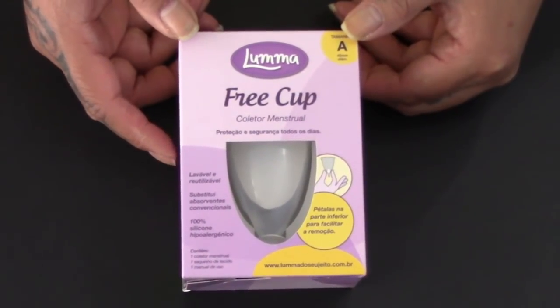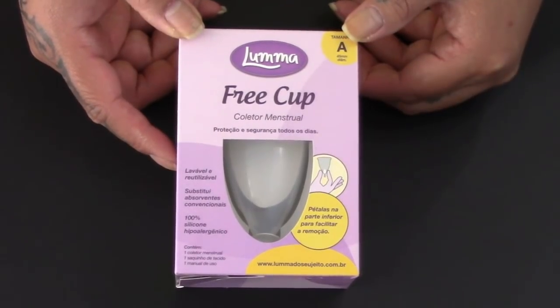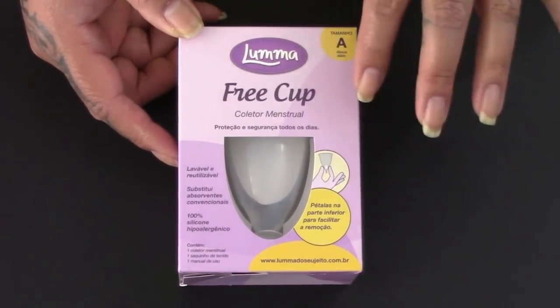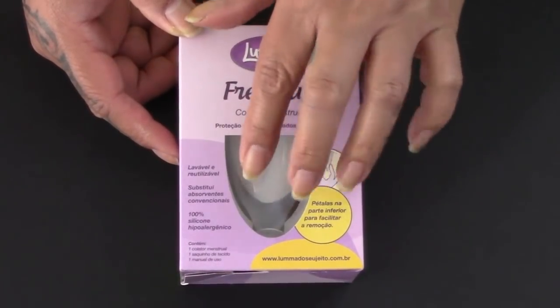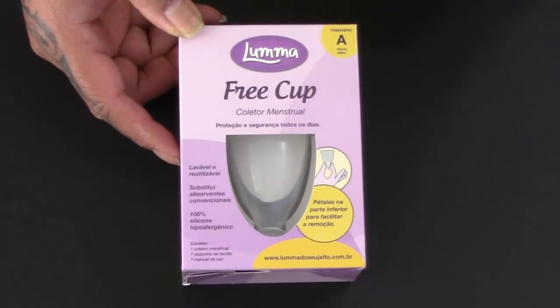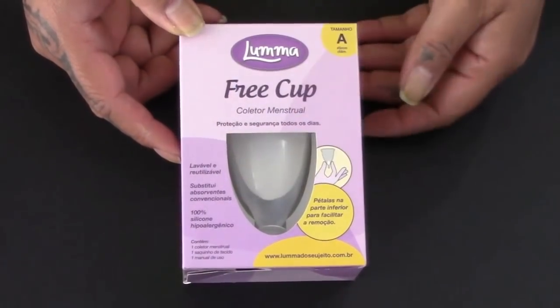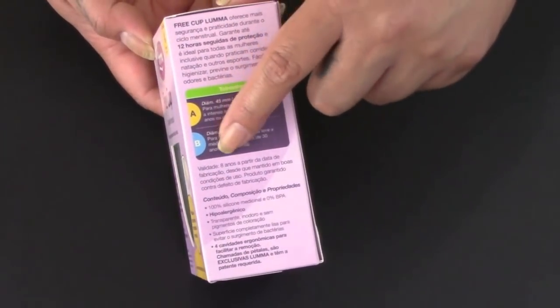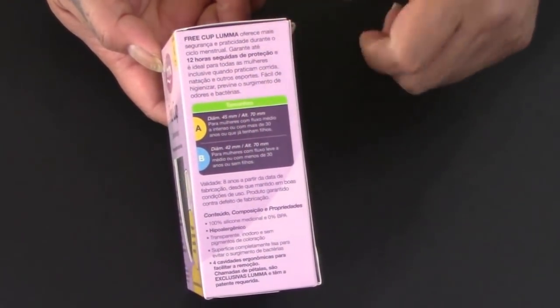And here are the Luma free cup and easy cups. I'll do a quick turnaround of these boxes. There are a couple of differences between all six. The high cervix cups have this window, while the boxes for the medium and the low cervix don't have that window. And then all of the boxes have a size indicator and also their measurements.